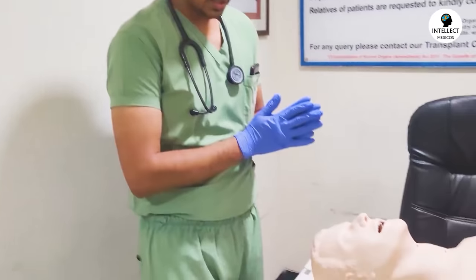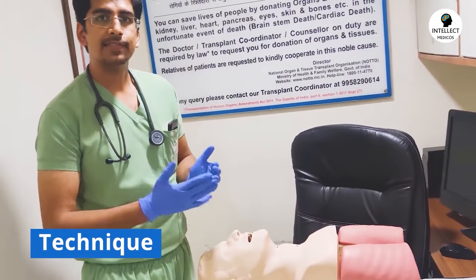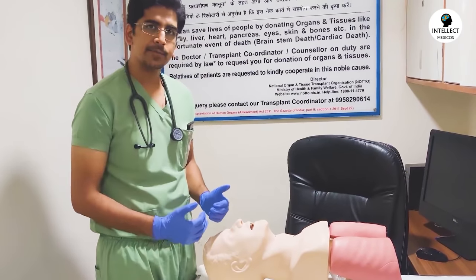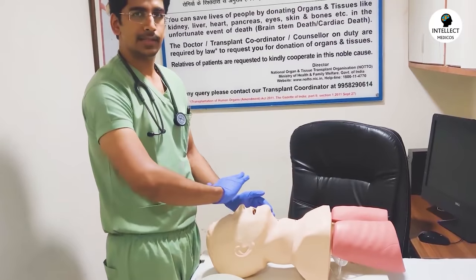Now for the procedure itself. First, observe universal precautions: wear gloves and a mask — mandatory especially in the COVID era. The position of both the patient and the rescuer is very important. The patient should be as close as possible to the rescuer, and the patient's head should ideally be at approximately the level of the rescuer's umbilicus.